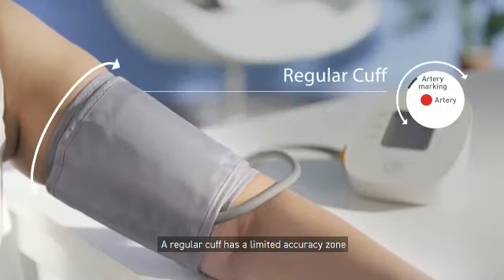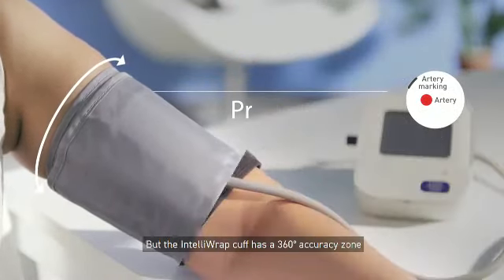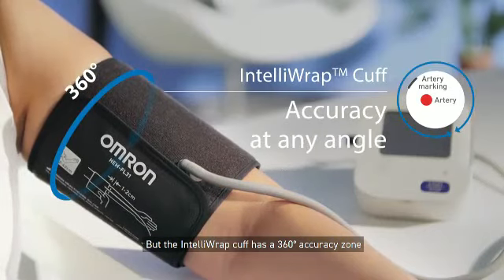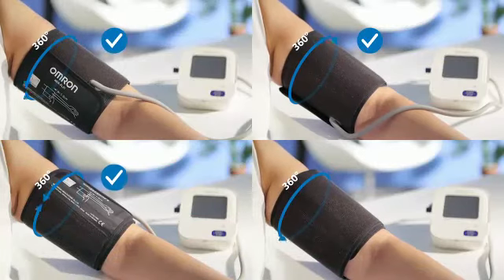A regular cuff has a limited accuracy zone that has to be placed exactly over the artery. But the Intelli-wrapped cuff has a 360-degree accuracy zone that ensures an accurate reading, no matter how you wear it.